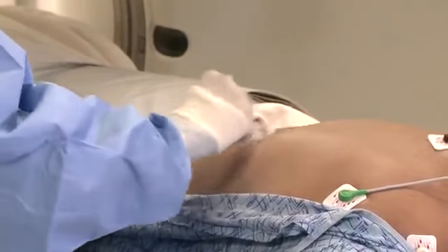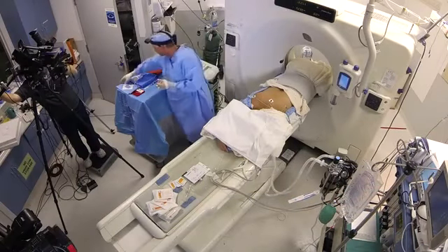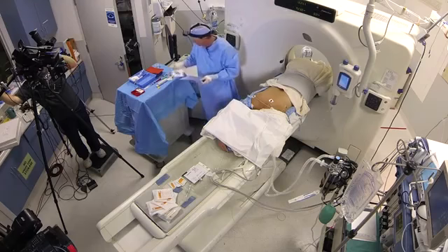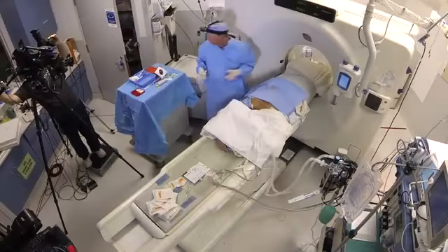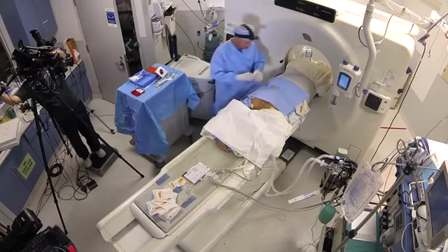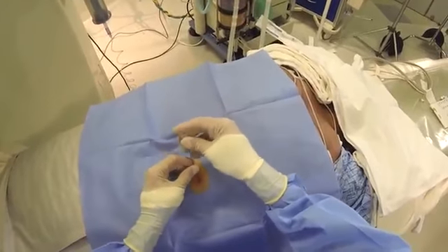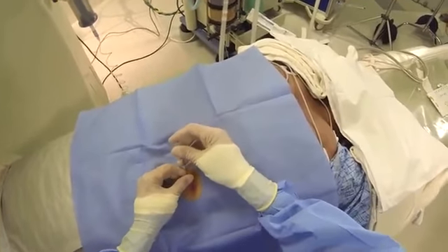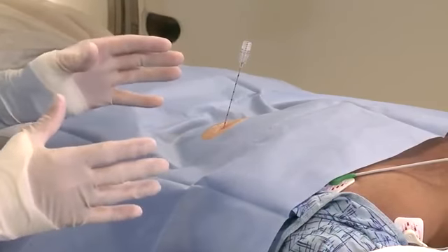So we're going to biopsy this lesion before we treat it. There's a 70 to 80% chance statistically that this is a cancer, and I always give people the option of biopsying at a separate setting and coming to treatment only if it's malignant, versus doing it all at one setting. And people tend to choose the one setting. I'm more in favor of that myself, given the vagaries of benign biopsy with the chromophobe adenoma.